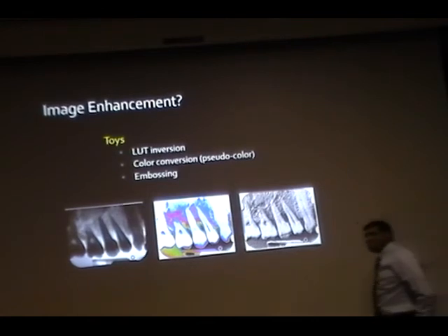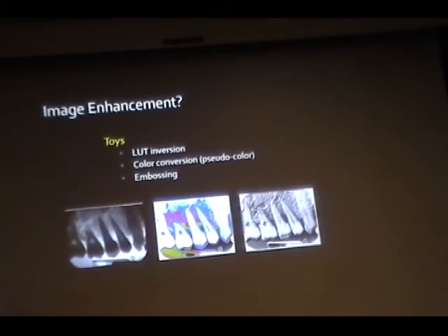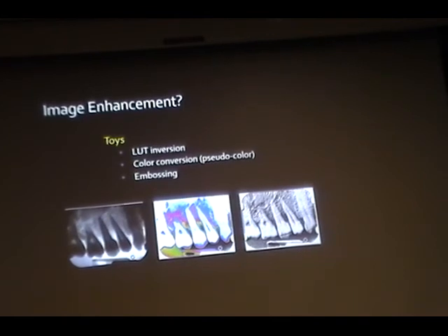So you said caries are going to be black, how black would it be? Again, depending on how much enamel is lost. So would it be darker than this black? Again, how much enamel has been lost. Dental caries is nothing but a loss of mineralization, right? So at least 40% of decalcification should have happened on the enamel to appear on the radiograph. No, I'm just curious how dark that is. I have multiple examples. Come to my office, I'll show you, okay?